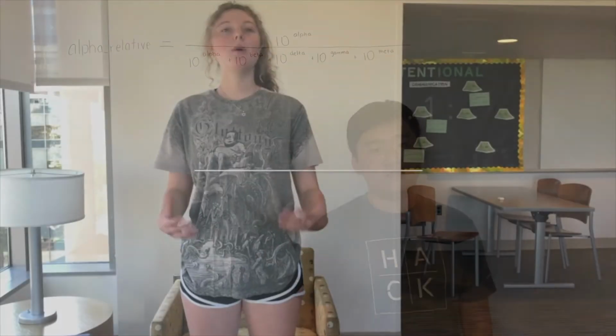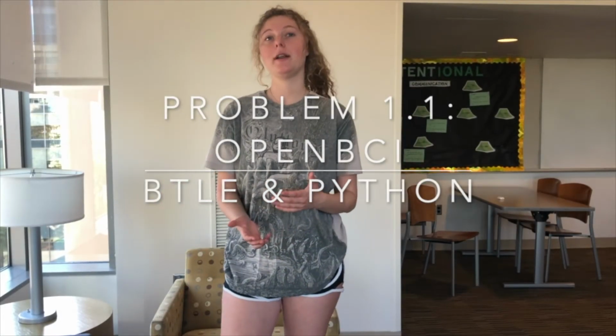One problem arose when attempting to use Python as a primary language to edit the EEG data. Originally, installing bluepy.btle, which is a Bluetooth low energy platform, produced many further complications. Many classes such as BluePy and BluePy Helper needed to be implemented and compiled, along with their own dependencies such as glib, endian, etc. After all of these missing libraries were finally installed and compiled, they needed to be linked to the core source file, and that produced further errors.